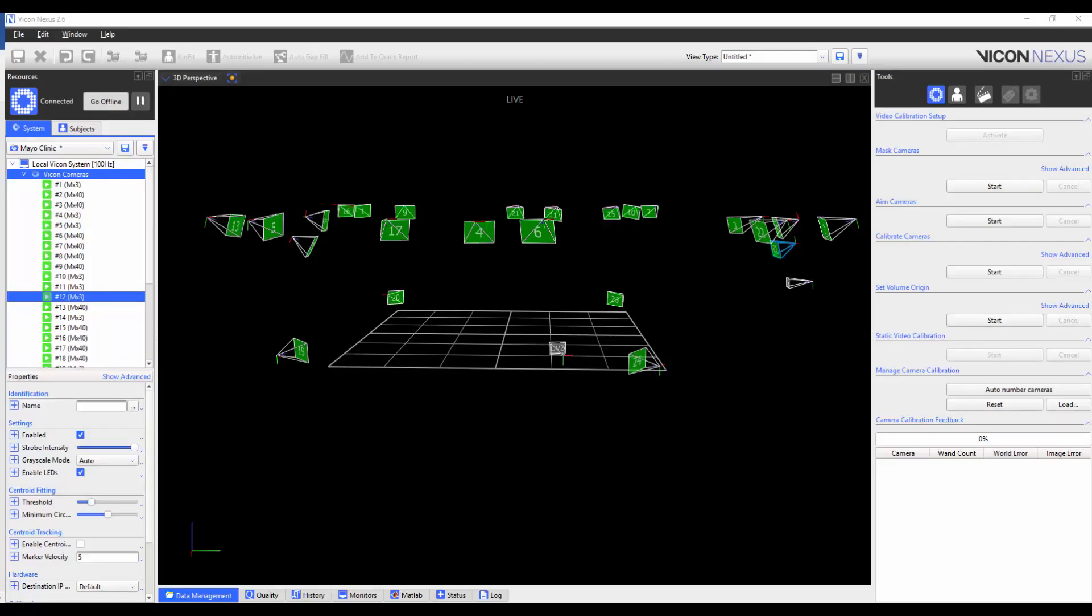The AutoNumber Cameras button will automatically number the cameras sequentially based on the position in the capture volume. It will pick the camera that is furthest from the volume origin and designate it as camera number one. The cameras are then numbered in a clockwise direction around the volume. If the cameras are positioned at different levels, the cameras in the level that contain the most cameras are numbered first.